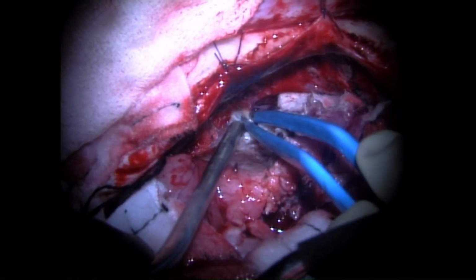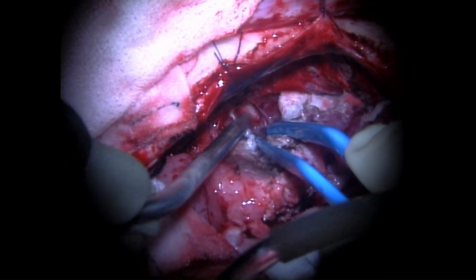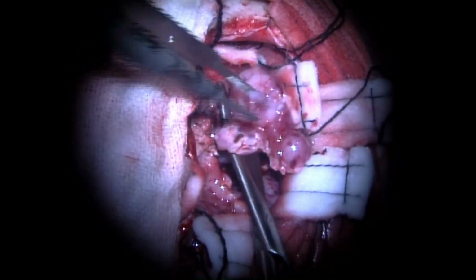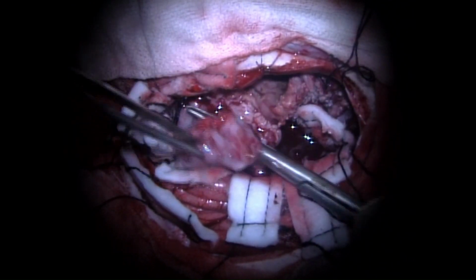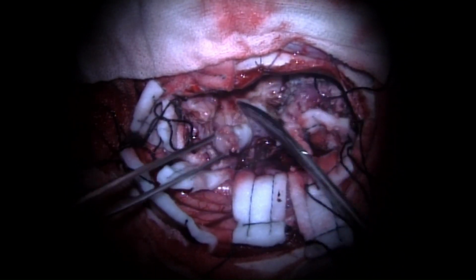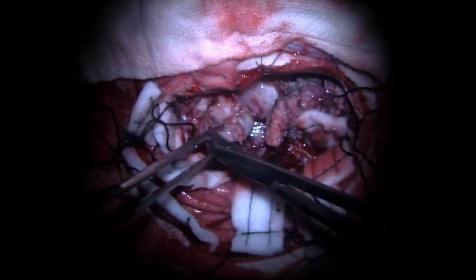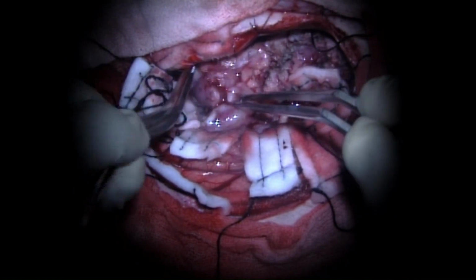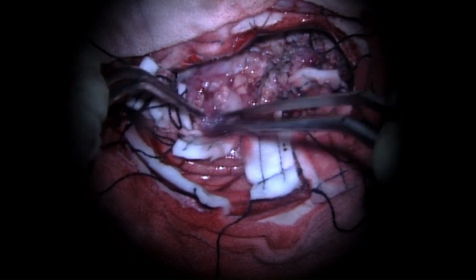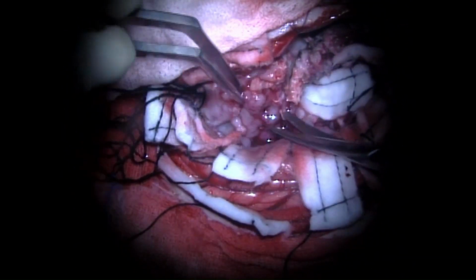In doing so, we are devascularizing the tumor. You can see further tumor being delivered from its attachment at the skull base. Again, you can see once the tumor is effectively devascularized by decreasing its blood supply from the falx as well as the dura, it was rather easy to remove this tumor piecemeal by delivering and cutting large pieces of the tumor.